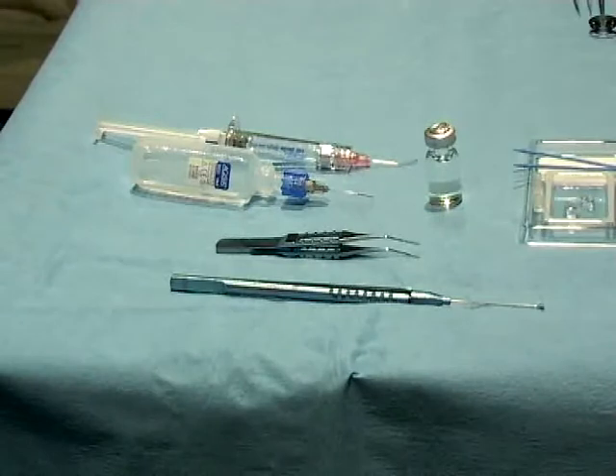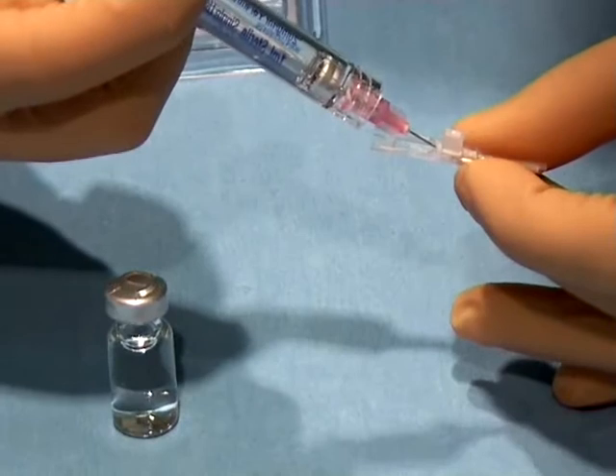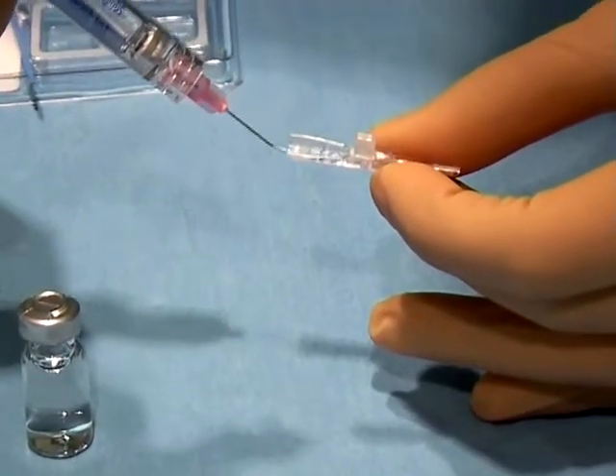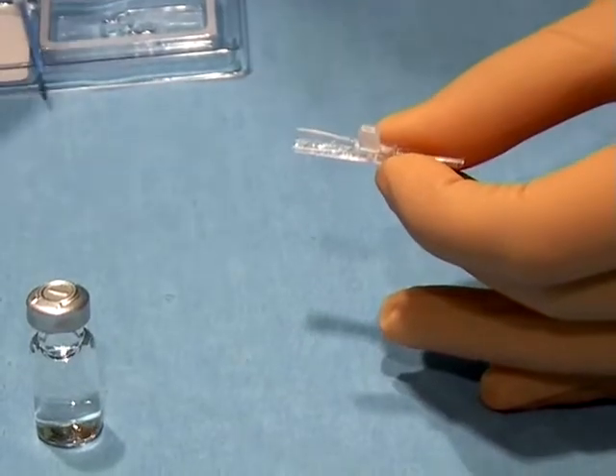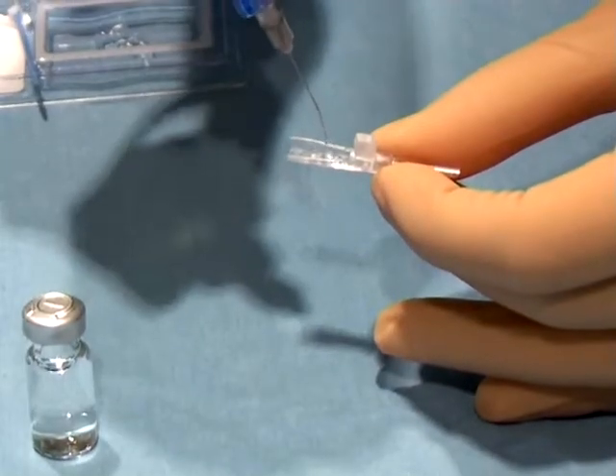To perform toric ICL surgery only few instruments are needed. The first step is to fill the cartridge with methylcellulose. Be sure not to overfill the open end of the cartridge. This space is filled with a few drops of BSS.